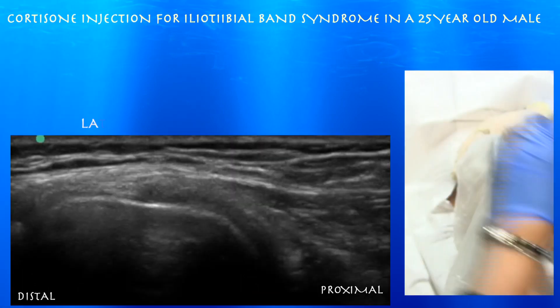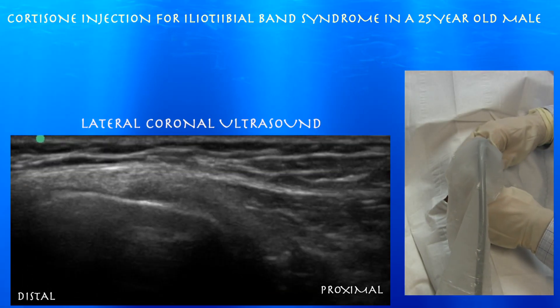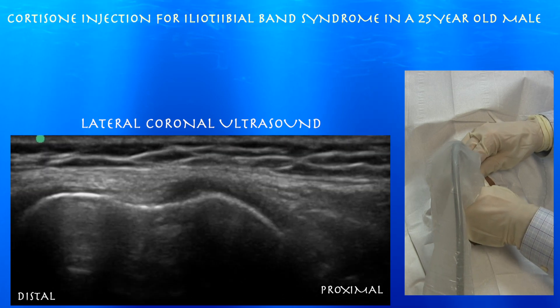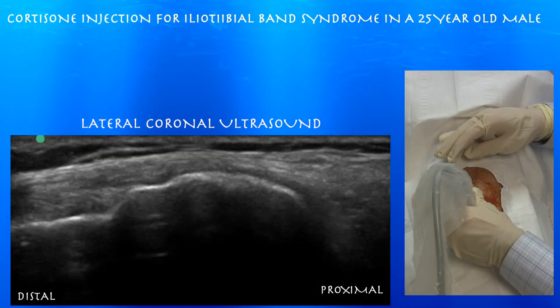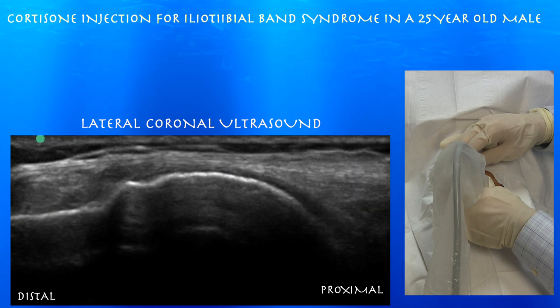Here's our first clip — we're going a little posterior, now anterior. You can see that iliotibial band just kind of gliding over the lateral epicondyle. Here we are running over the lateral epicondyle — you can see the iliotibial band.